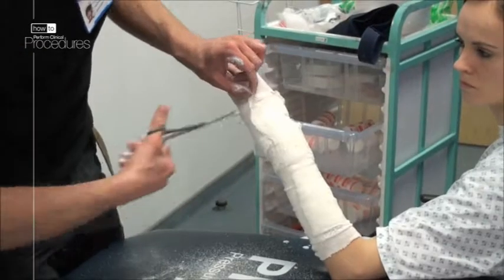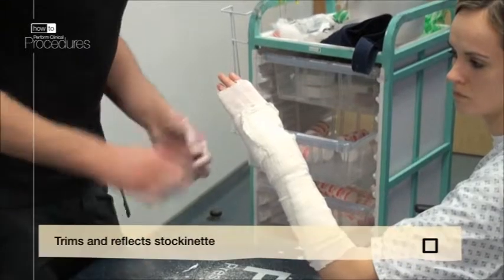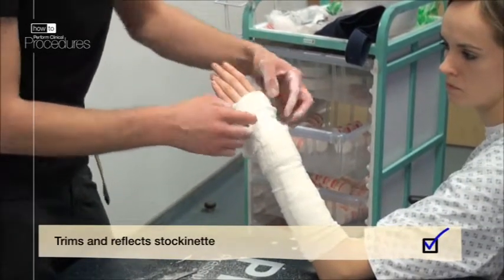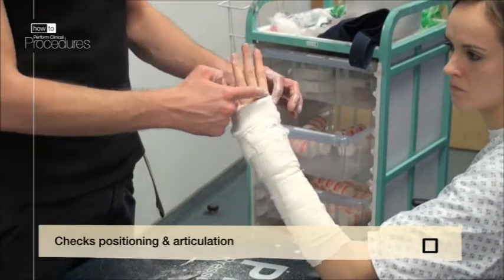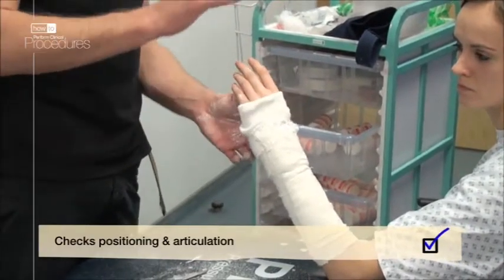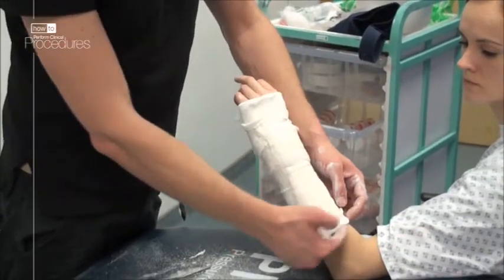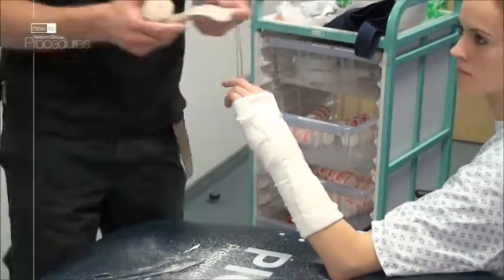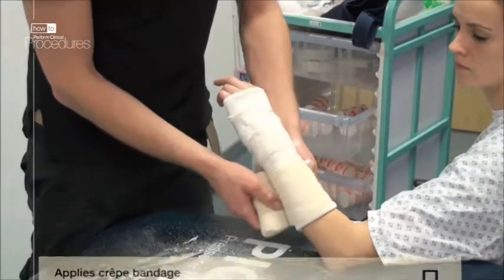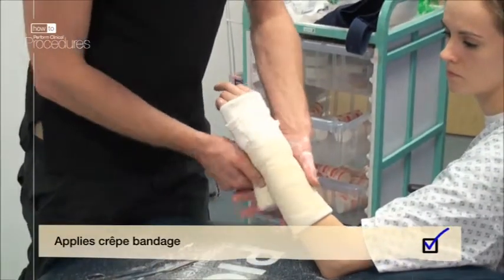If you need to trim the edges, finish before the undercast padding. Reflect the stockinette and check that the metacarpal heads can be visualized. Check articulation by asking the patient to wiggle their fingers. Reflect the proximal stockinette and padding in a similar fashion. Take the pre-soaked crepe bandage and, again starting at the elbow, work your way towards the fingers with 50% overlap on each turn.